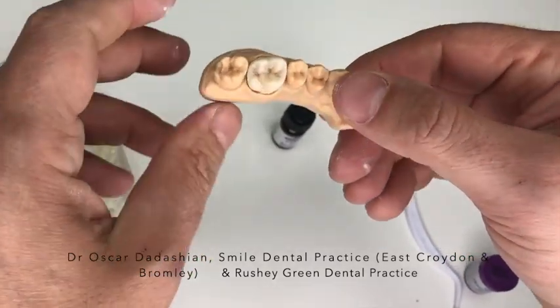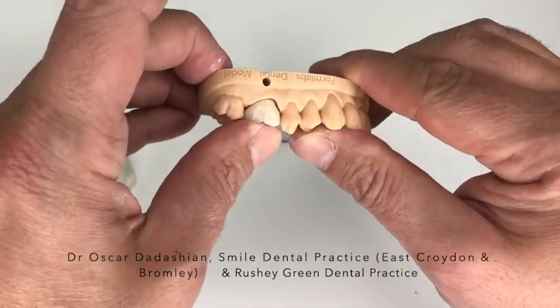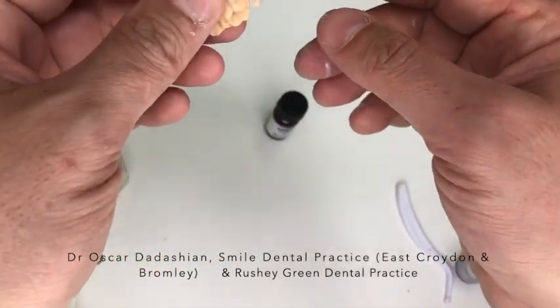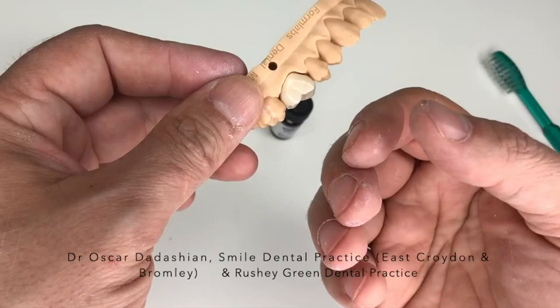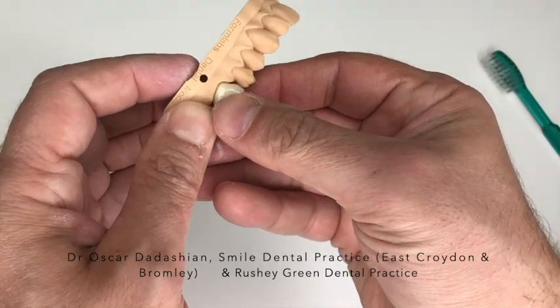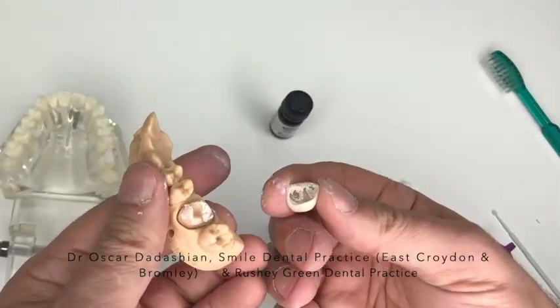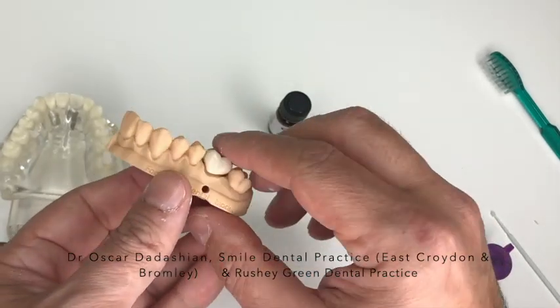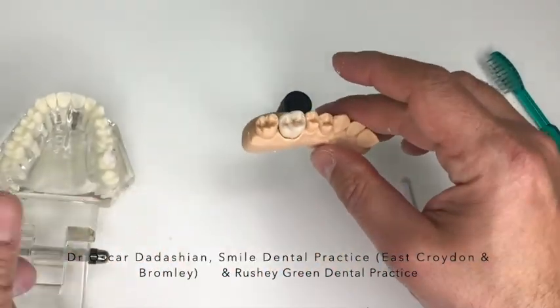Make sure it goes in and it feels comfortable. Now, if you put too much material in there, when you bite together, it's not going to go in. Even if you put pressure, it's not going to go in. So that's very important that you don't put too much material in. But what if that happens? What if you put it in, you bite together, and it's very hard, it's too high, you can't push it any further in. It's going to take a while for this to set, 2 to 3 hours. So you feel free to remove the crown. Again, brush everything, brush this clean, remove some more of that material, and then pop it back in again and try it back in. And again, just bite together and make sure it's all in.